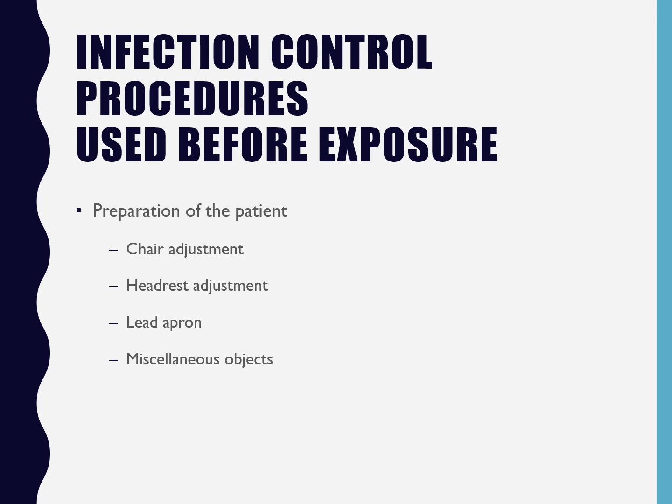And then turning the chair as well. You're never going to want to turn the chair in order to swivel and turn the patient maybe towards you or away from you by touching anything that's not barriered. So once your gloves are on, you're only touching barrier to barrier.